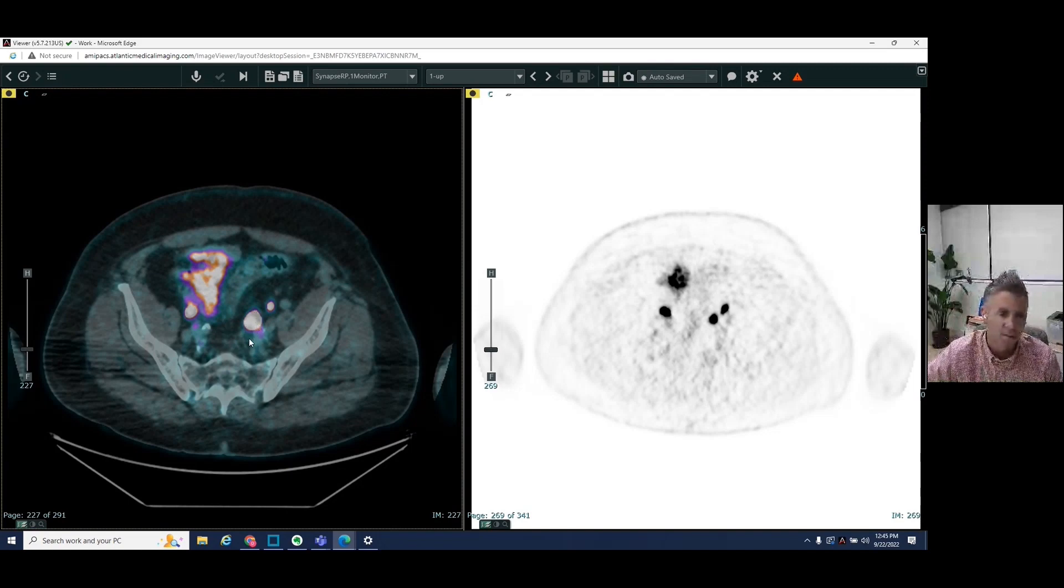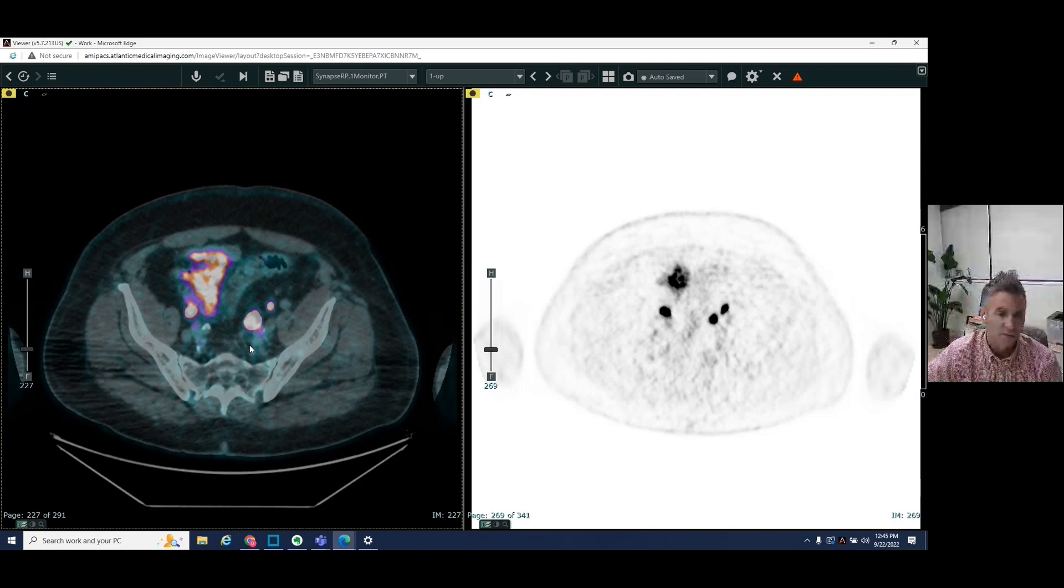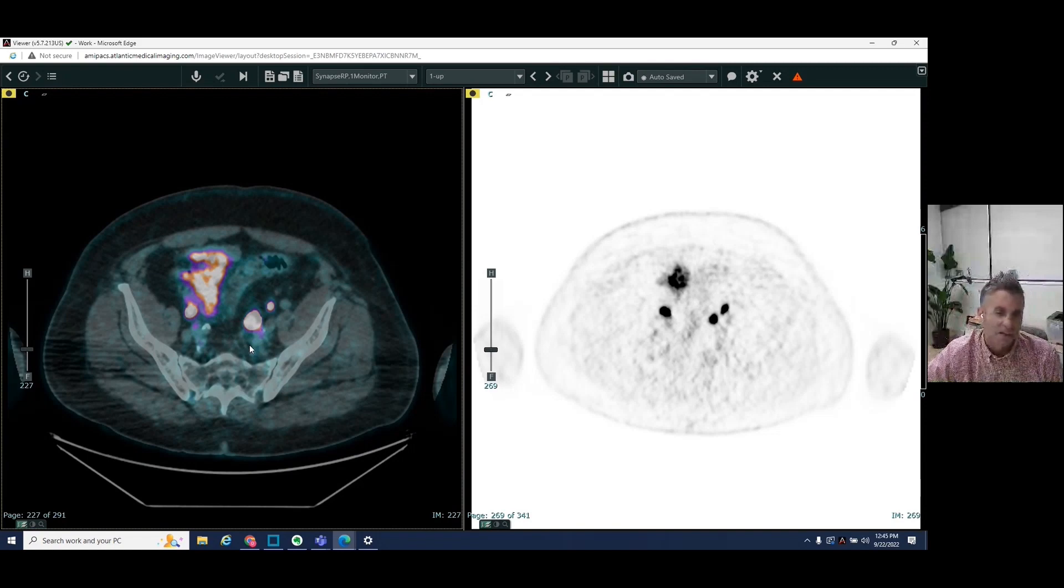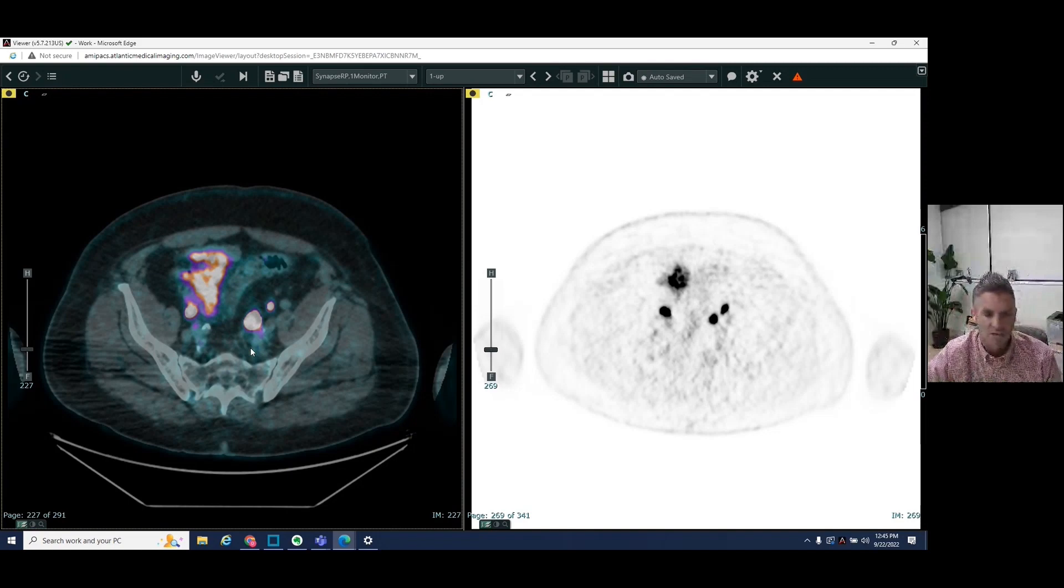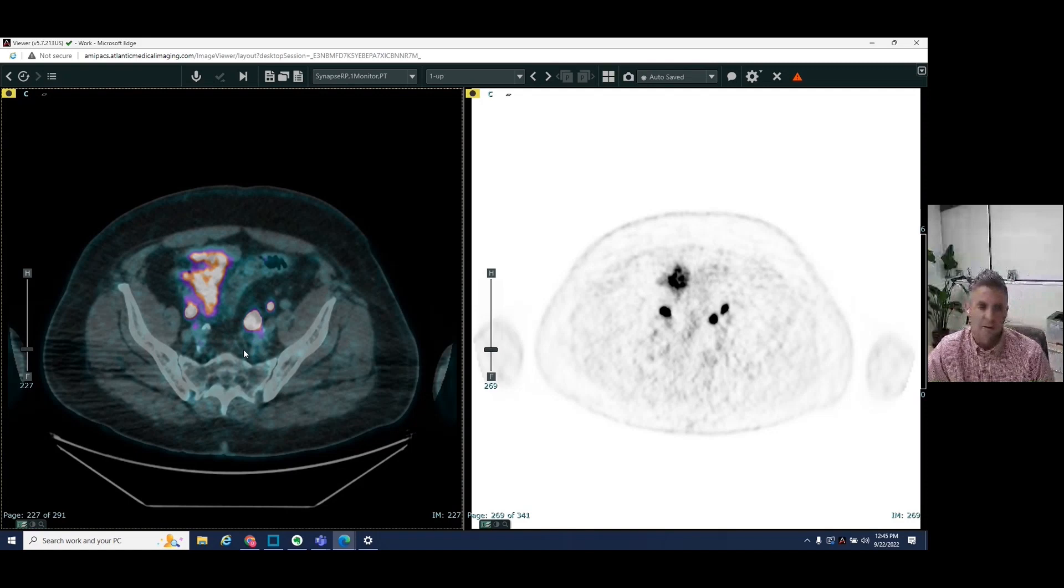And so this patient had two recurrent lymph nodes and we were able to help target these. And the patient then proceeded for further radiation therapy.